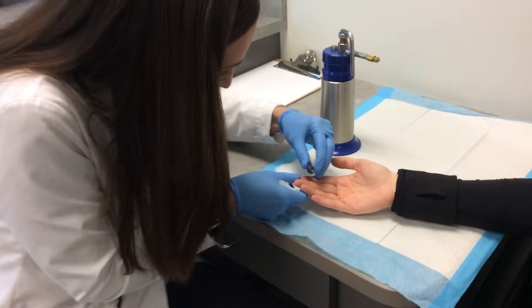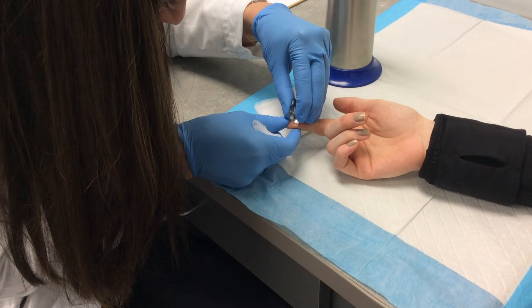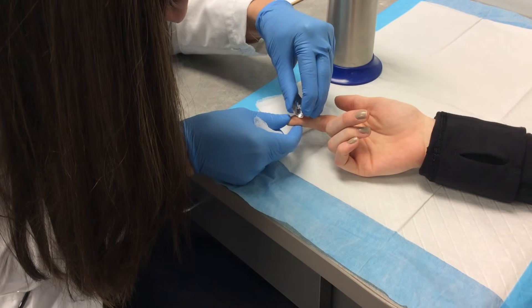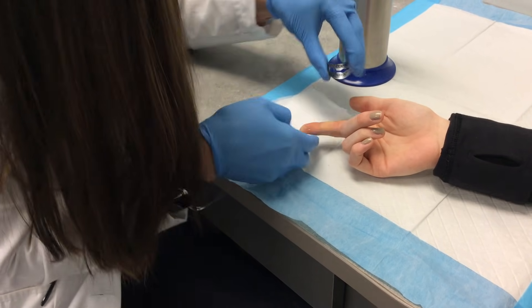So first we pare it down — just take off all that dead tissue. Excellent.